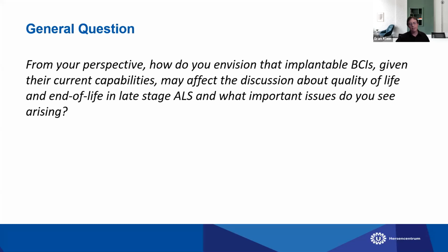And second, I think it raises some really interesting questions about timing. Whether or not that means you may have people who want to undergo the surgery very early and be able to maximize their ability to learn how to use the system. And that might involve having surgery even before they need to use the system, right? Versus people who might want to wait and maximize their current quality of life and not undertake the risks of this sort of system. So I think the timing question is going to be really important here.